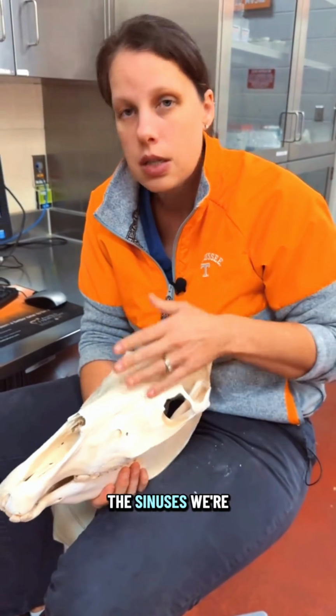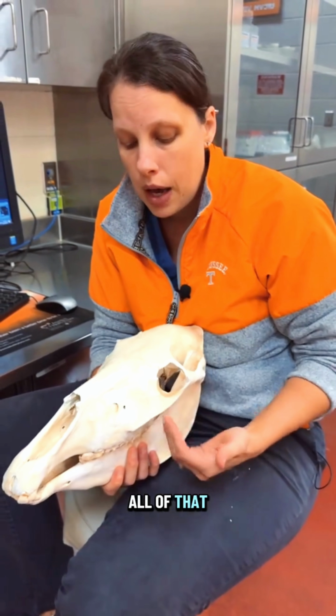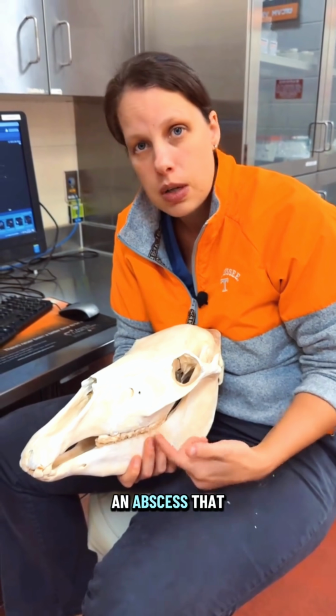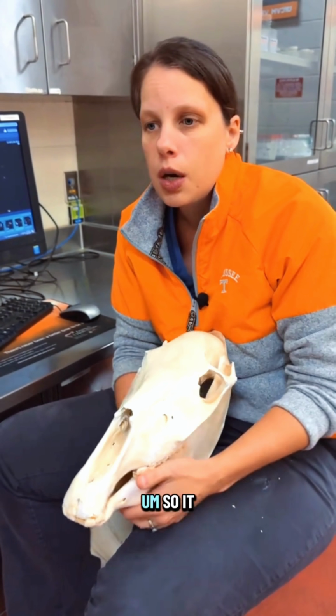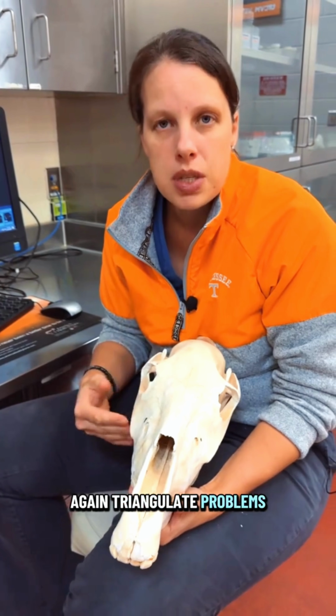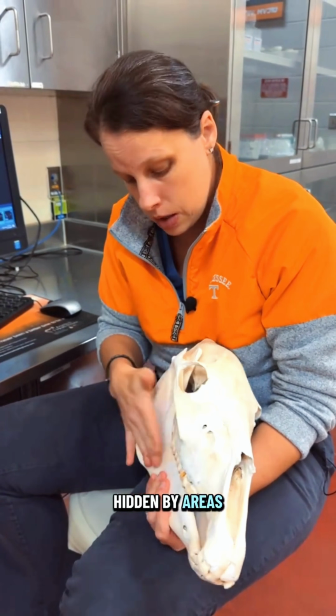We can see the sinuses. We're not affected by all of that. We can see exactly which tooth is affected with an abscess that may need removal. So it really helps us, again, triangulate problems that otherwise are hidden by areas of the bone.